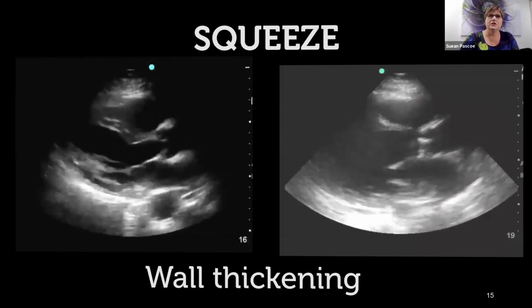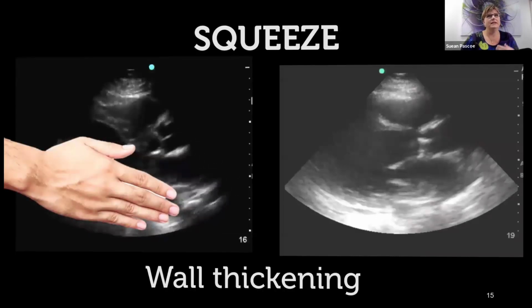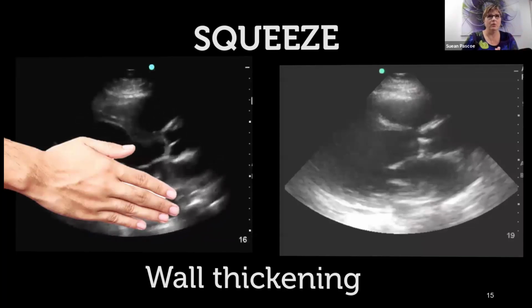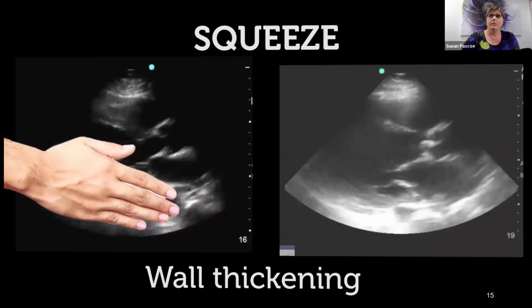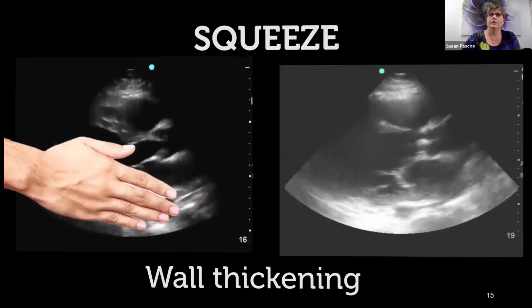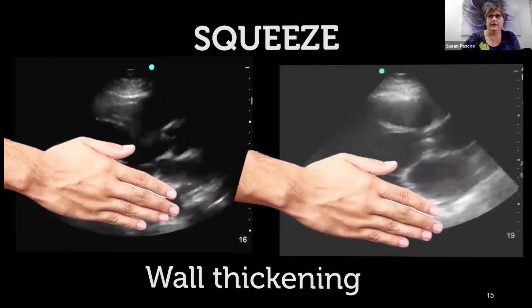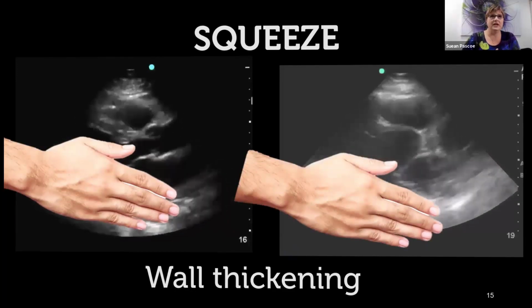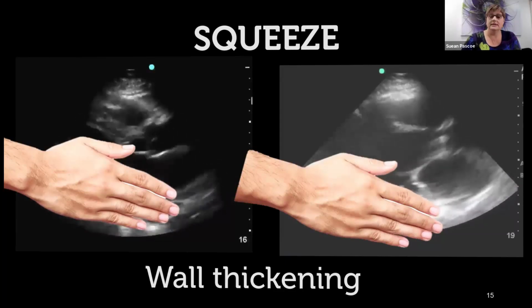But what I tend to do here is if I cover up the bottom half of my screen there, then it makes my eye focus on the ventricular septal wall to see if that wall does thicken as the heart squeezes. And then when we come over and see this abnormal wall, you can see if you cover it up, there's not much activity happening there, and there's not much thickening of that interventricular septal wall as the heart squeezes.